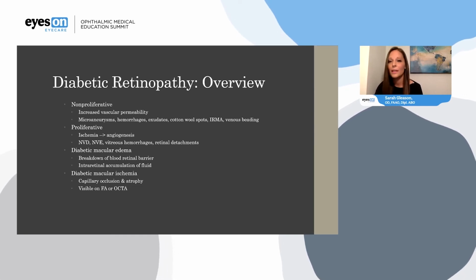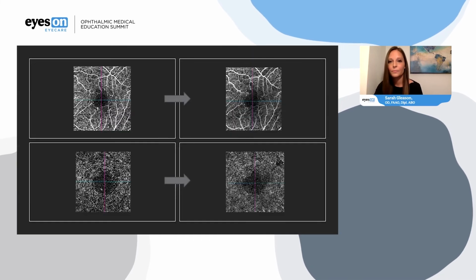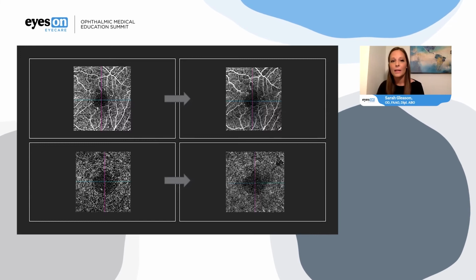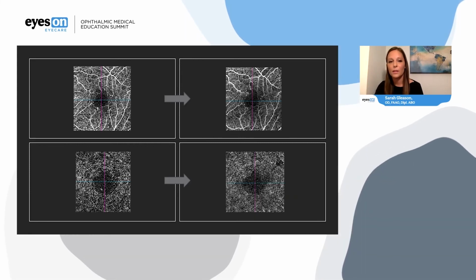Previously, we weren't going to refer our mild patients to get a fluorescein angiography since it's a quite invasive procedure if it wasn't really indicated. However, with the advent of OCTA, we can actually document this on our patients very early on in the disease process. So again, I pulled up the patient's left eye, the areas of macular ischemia compared between that visit 3 years prior and the visit 3 years later.